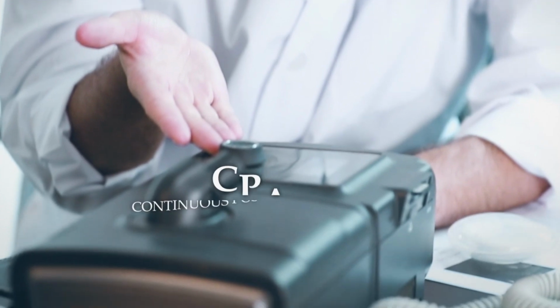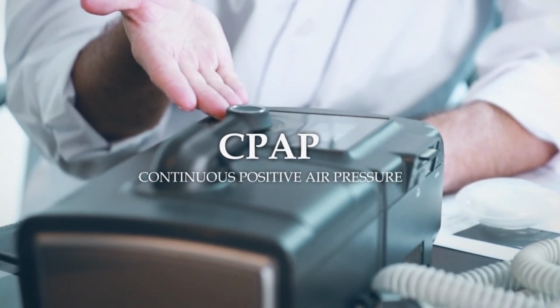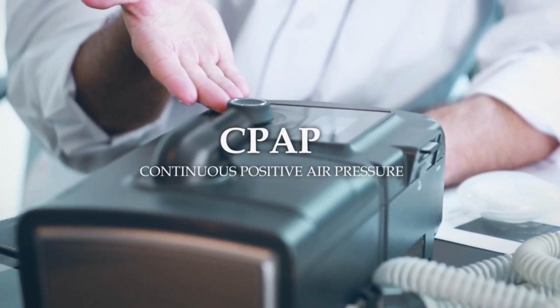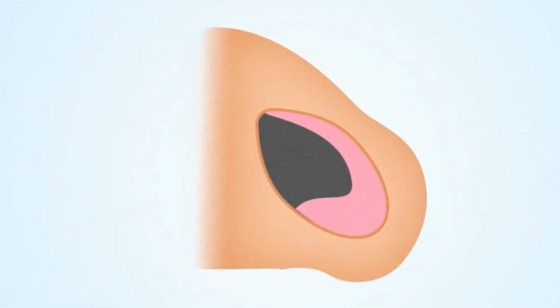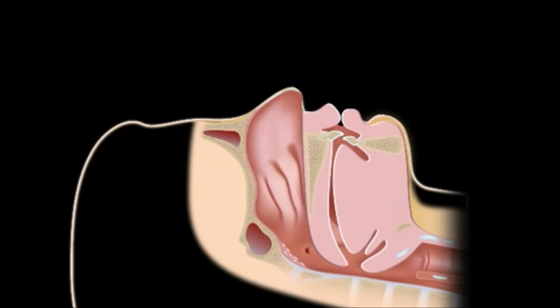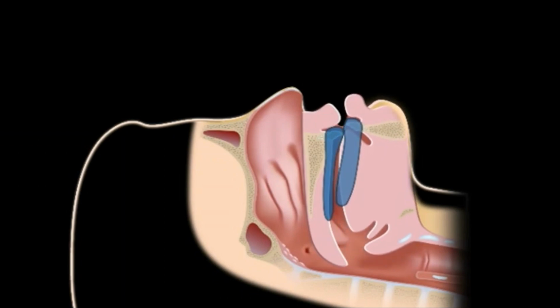For therapy, most people start with non-invasive options, such as CPAP, which uses continuous air pressure to keep the airway open. It is especially effective for multi-level collapse, although it may be less effective when nasal congestion or epiglottis collapse is present. Another option is a mandibular advancement device, also known as an oral sleep device, which gently moves the lower jaw forward to improve airflow. When the collapse is on a single site, treatment can be tailored to that location.